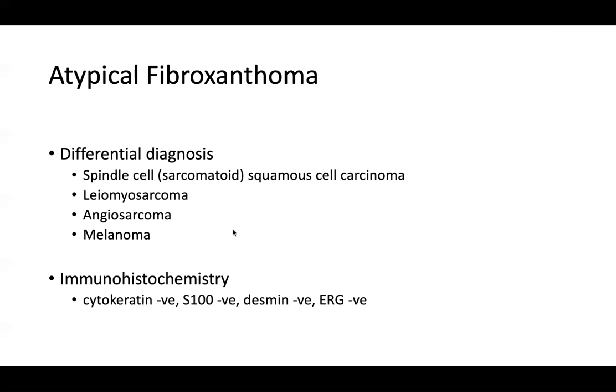Melanoma, so you'll want to do your SOX10 stain and you'll want to do your Melan-A stains as well, but definitely a melanocytic marker. And I will say that PRAME is positive in melanomas. But in the spindle cell variant of melanoma, the PRAME stain is usually positive in only 30 to 50%, depending on the paper that you read. However, keep in mind that PRAME is a marker of malignant behavior. So that is currently being studied quite closely.